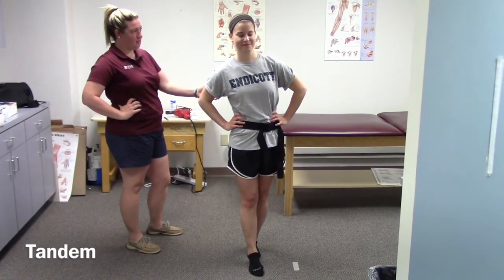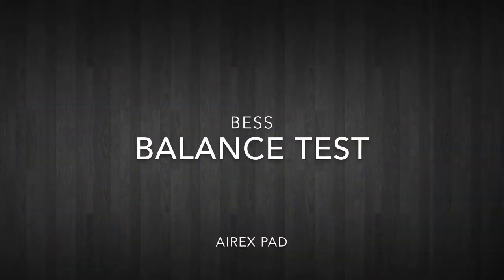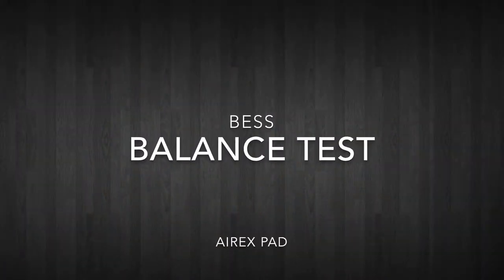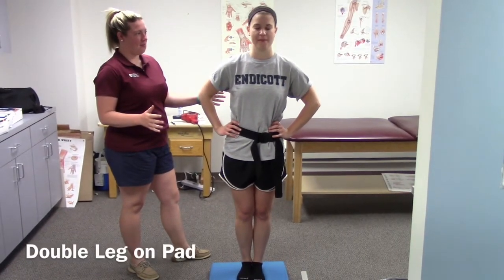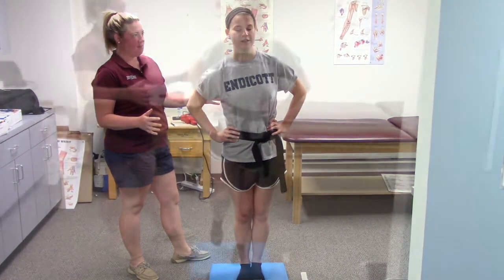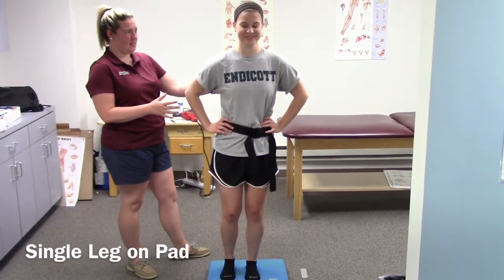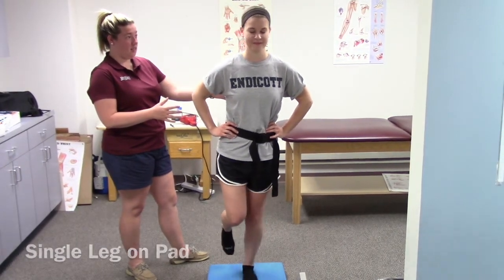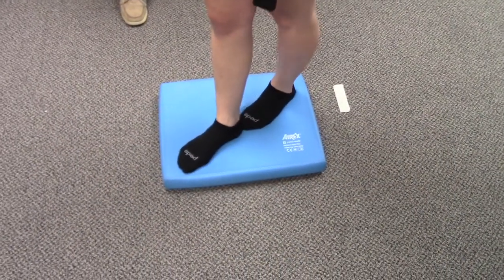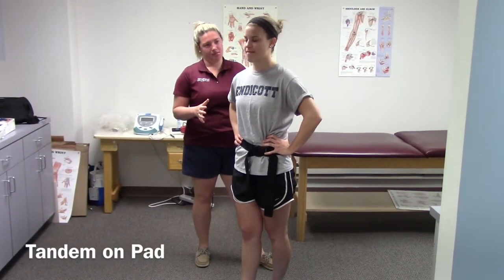Errors being losing control of their position, putting a foot down, taking a hand off their hip, or opening their eyes. After each stance, the system will ask you how many errors you counted, and to record by choosing the appropriate number. When the athlete is on the pad, make sure you are spotting the athlete and catching them if they fall. To conduct the tandem stance on the pad, make sure the athlete's feet are diagonal from corner to corner.